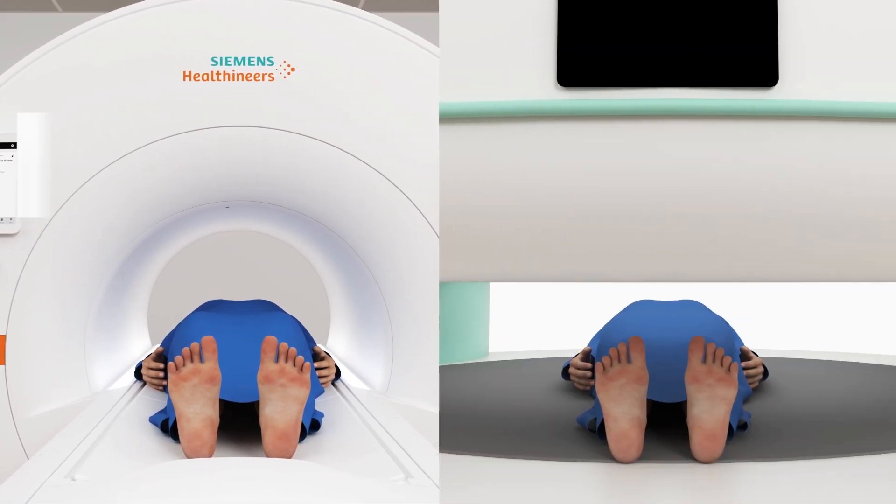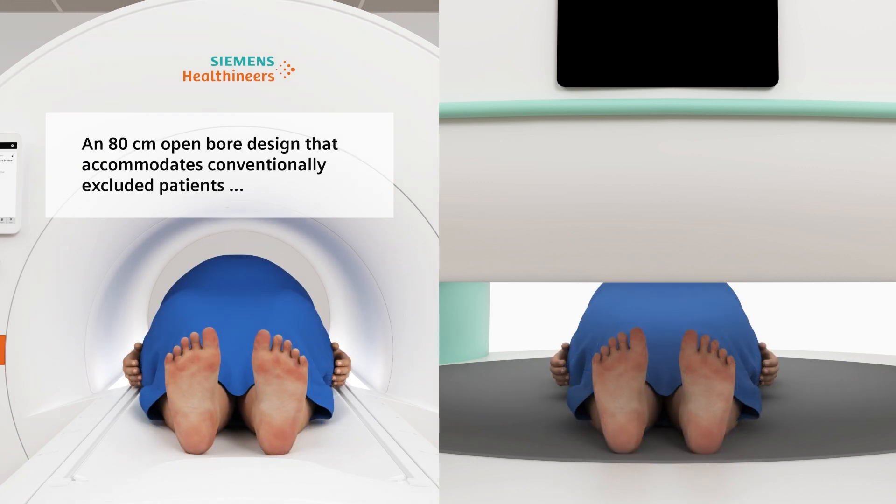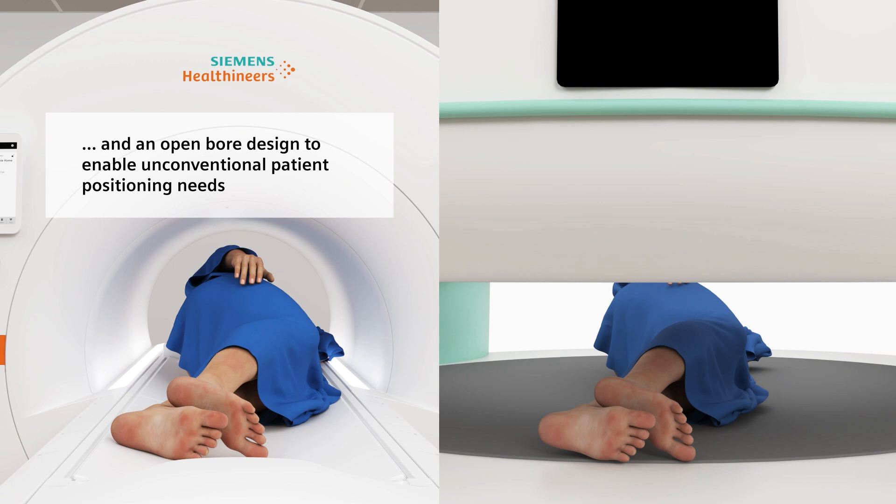Conventionally excluded patients can feel welcome in the 80 centimeter open bore design of the Magnatome Freemax. The system also enables unconventional patient positioning needs.